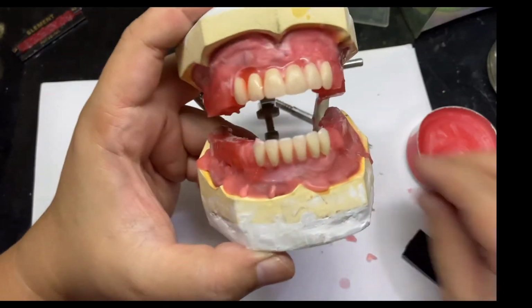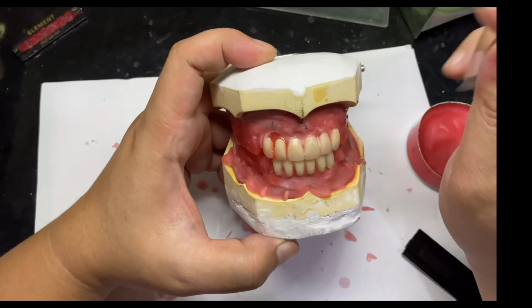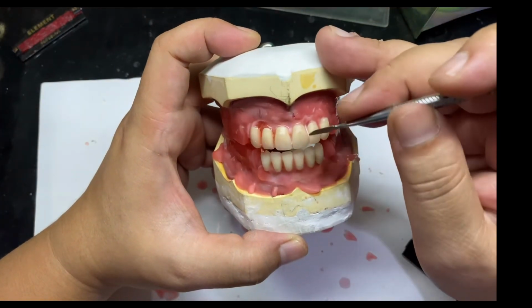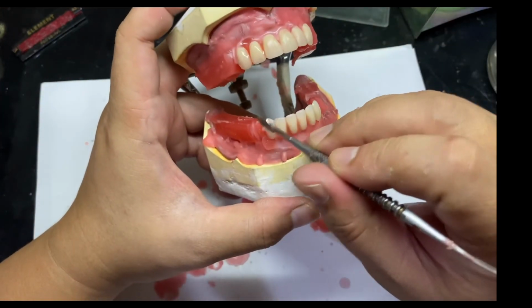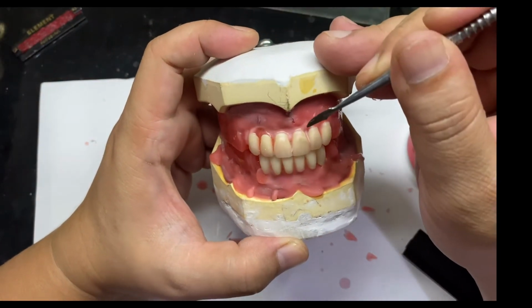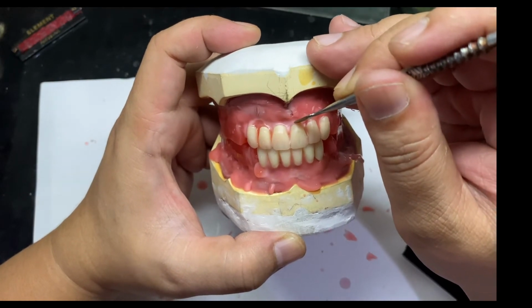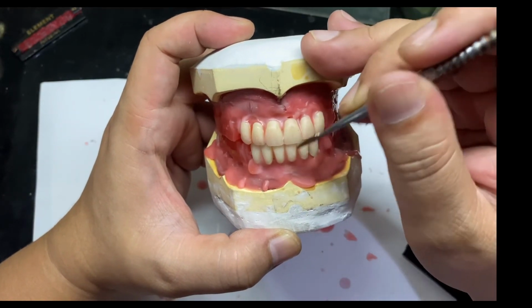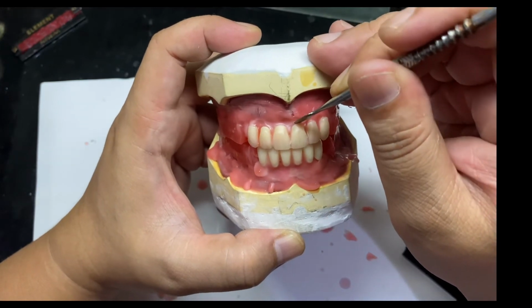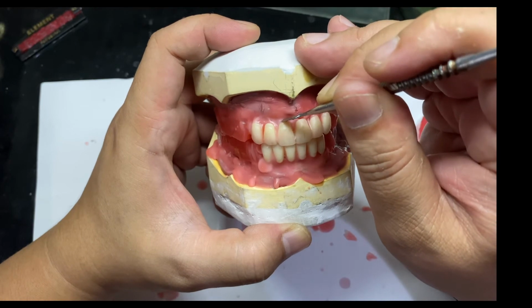If I want to adjust the central incisor and make it a little bit longer, I will simply use a carver, push it towards the neck portion, and if you want to put it downward, you just have to push a little and then push down a little.